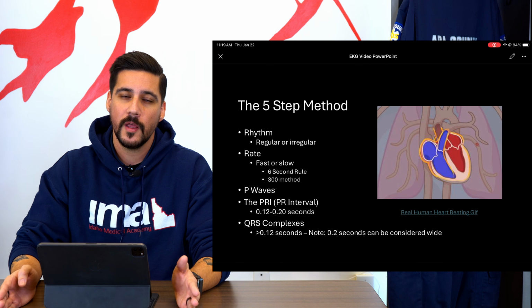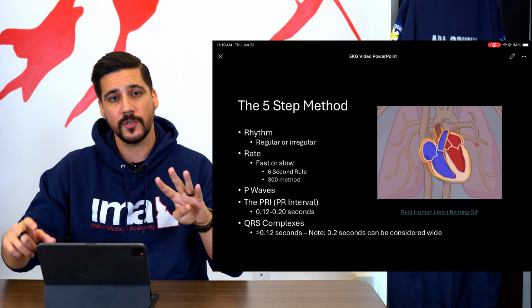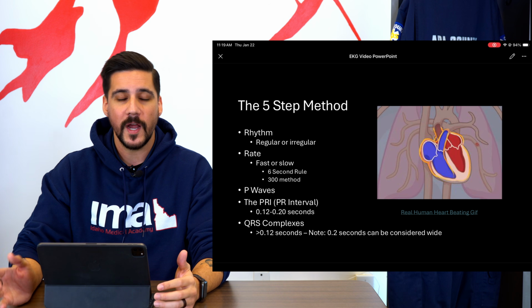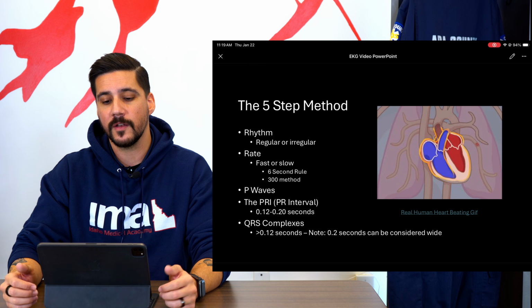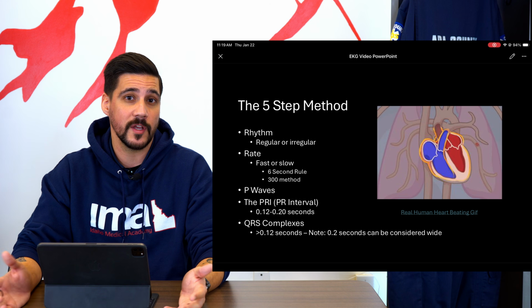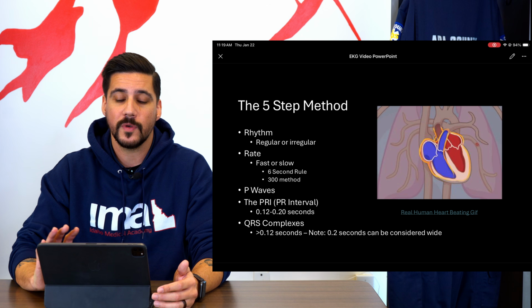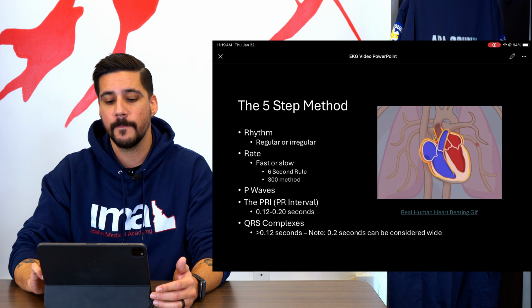So this is where greater EKG knowledge, when you're reading the actual 12-lead strip, not just our 4-lead strip, really comes into play. Wide complexes can indicate potential malfunction of the heart, or can kind of make a little murky our diagnosis of things like heart attacks or STEMIs, which is something we can see on a 12-lead EKG. You cannot diagnose any STEMIs on these 4-lead EKGs, okay?